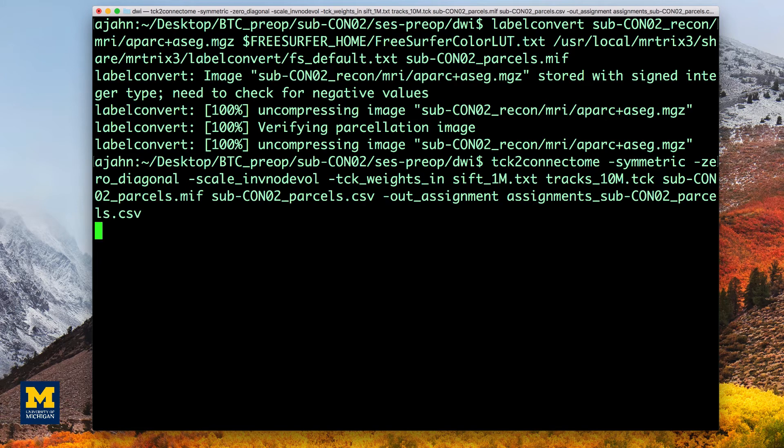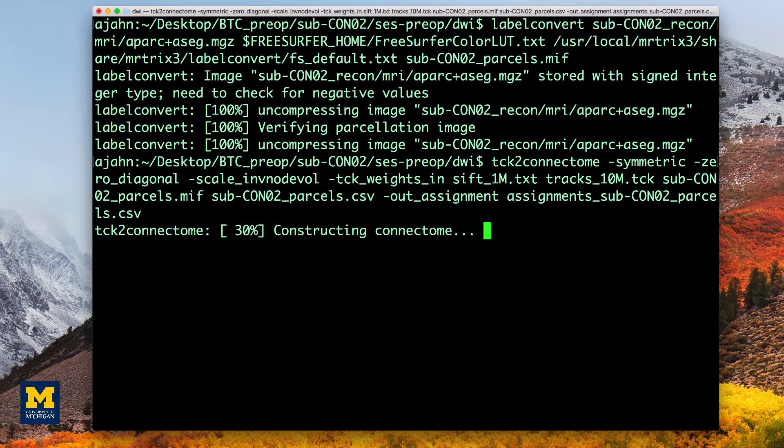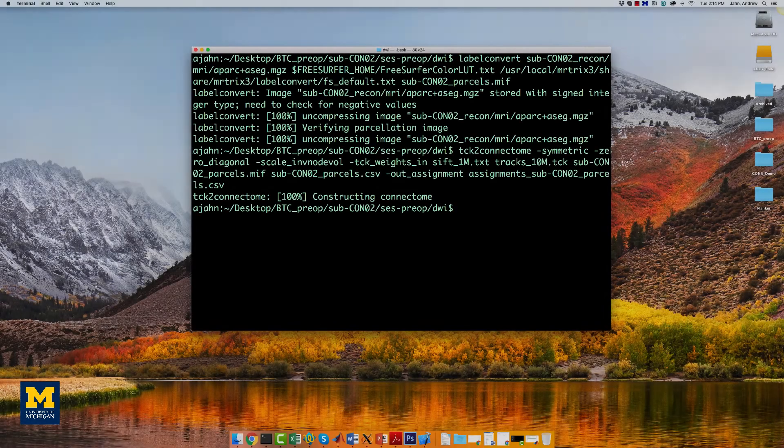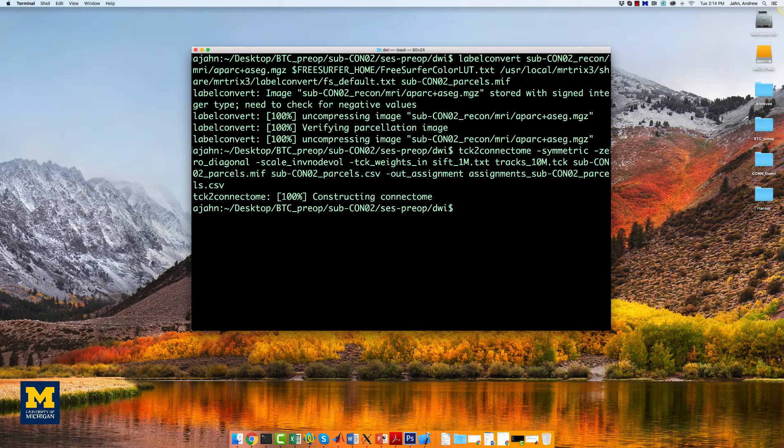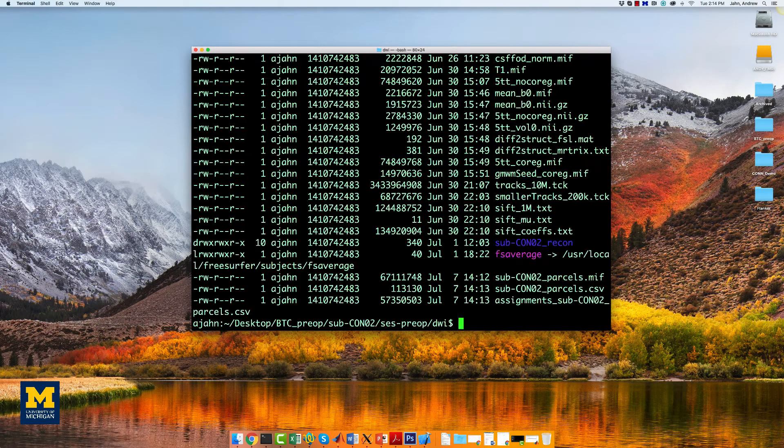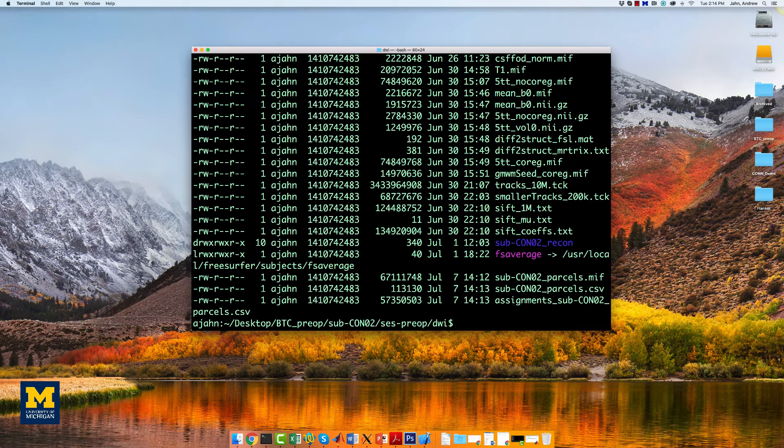Creating the connectome will take a couple of minutes, so I'm going to fade out here and come back once it's done. Once you have created the parcels.csv file, you can view it as a matrix in MATLAB.